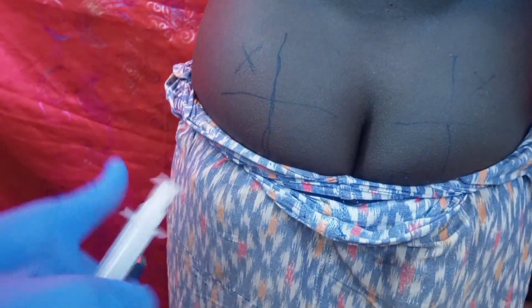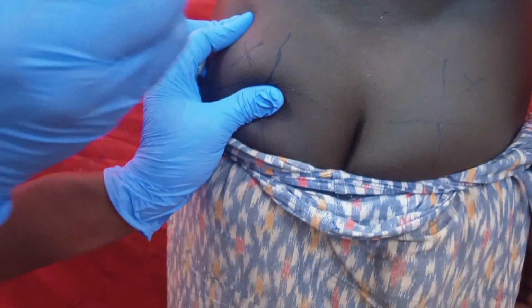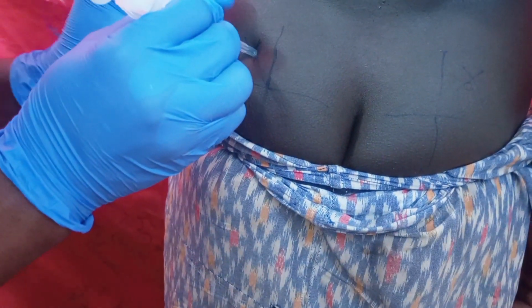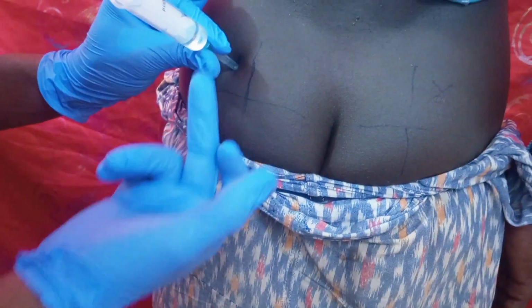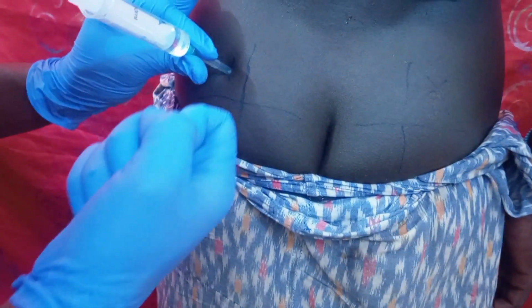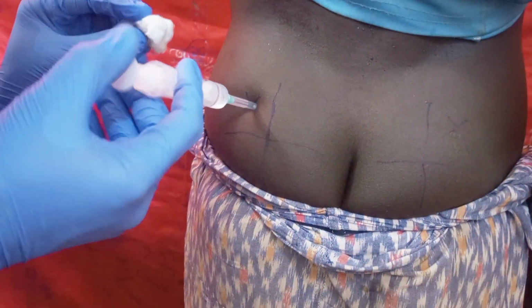What you do, first you grab the skin. You hold the skin like this, you insert the needle 90-degree angle deep into the muscle, then you release the skin, then you hold the cap of the needle and pull back the plunger to check for blood entry. If there's blood, you remove the needle from the muscle, then you start a fresh injection. And if there is no blood, you can give the medication safely without any interruption.